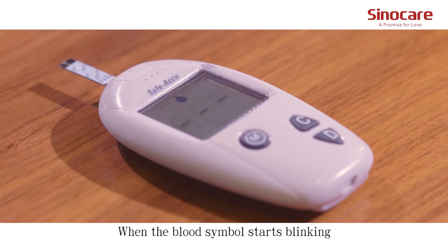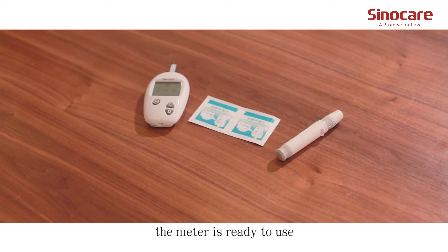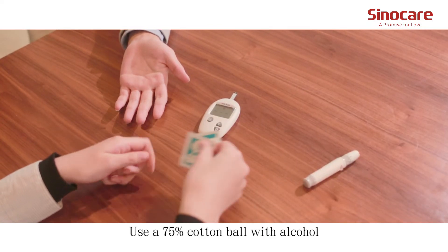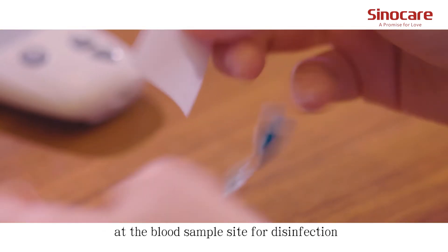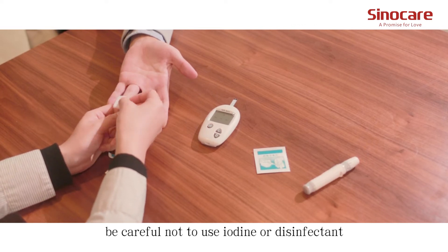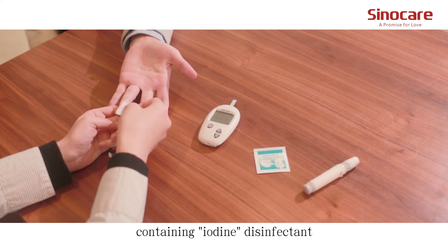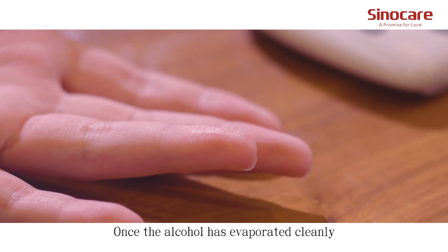When the blood sample icon starts blinking, the meter is ready to use. Use a 75% alcohol cotton ball to disinfect the blood sample site. Be careful not to use iodine or any disinfectant containing iodine. Once the alcohol has evaporated, proceed.